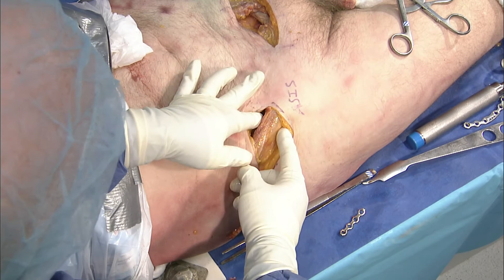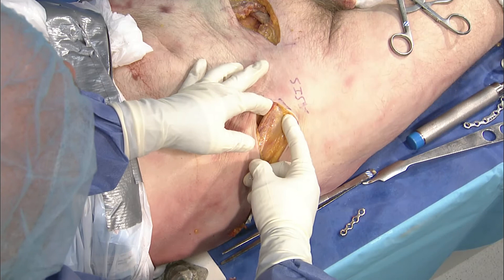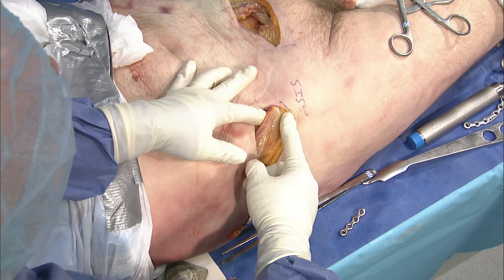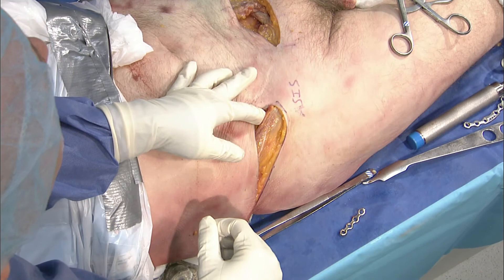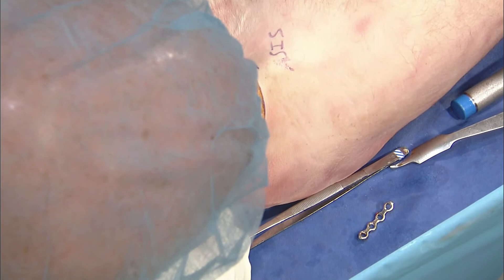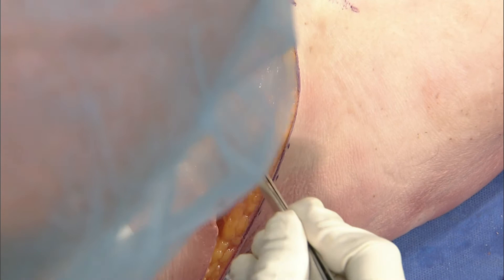As Dr. Sadi mentioned yesterday, plan the osteotomy ahead of time. Whether a step-cut osteotomy or a simple osteotomy, leave as much of the muscle bellies on the osteotomy as possible so it can be digastric. If you didn't have the chance to do that osteotomy, go ahead and do it now and see how far down the anterior column it gets you. For the anterior aspect of the SI joint, it's a typical lateral window exposure — you can see where the external oblique was reflected over the top of the ilium.